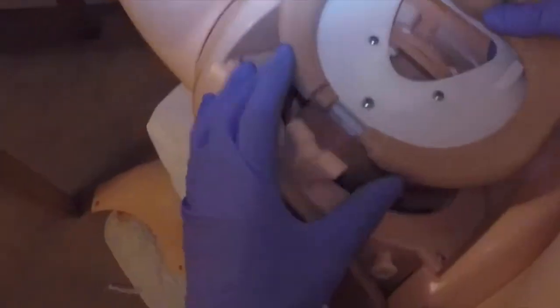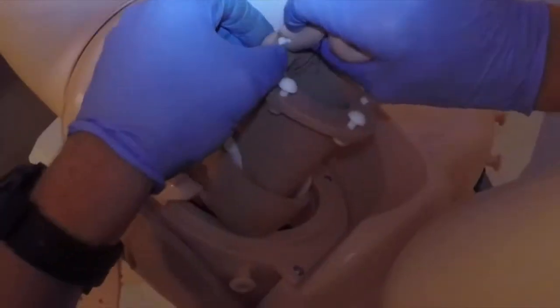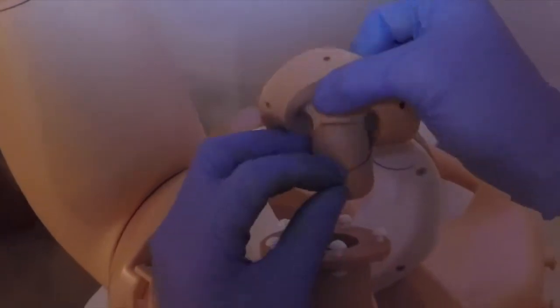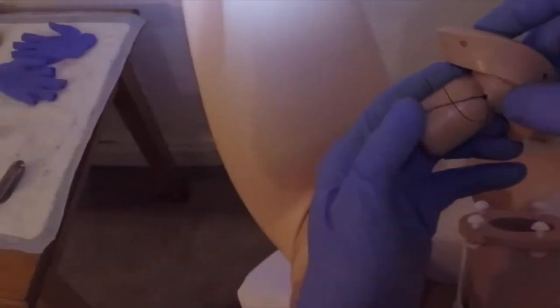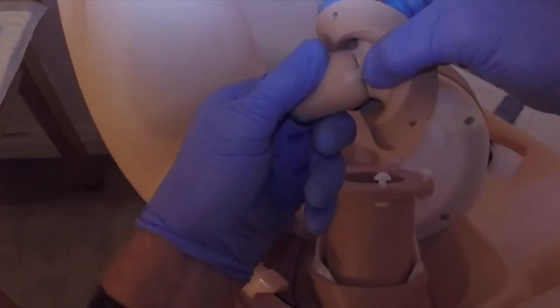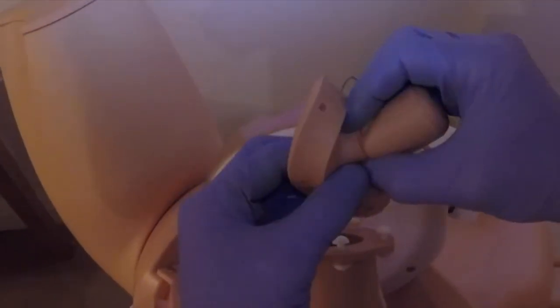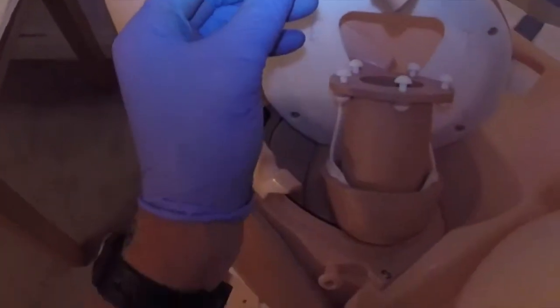We can take the module out and the cervix comes off quite easily. I'm fairly happy with that — it's quite high, certainly as high as I could possibly get it, and it seems to be reasonably tight. The threads are probably longer than I was expecting, but I'm pleased that the suture hasn't gone too deep. Most of this suture is encompassing the cervix and squeezing all of it, so there's little tissue left outside. Whether this relates to better outcomes, of course, we have no idea.